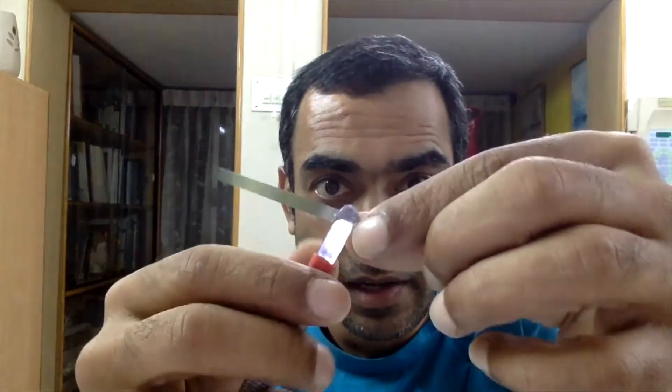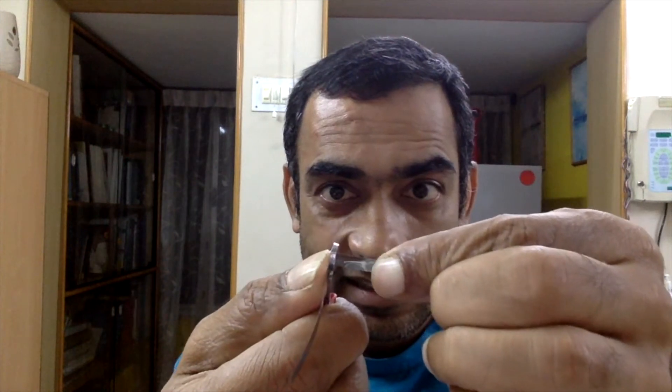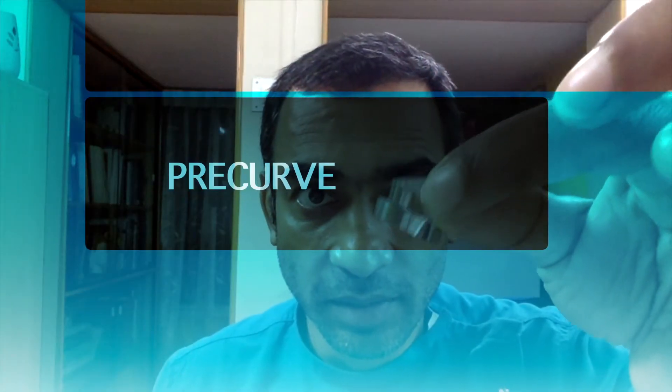Now you have to treat your matrix band. Your matrix band is a flat piece of metal, but your tooth is curved — so you need to pre-curve it. Use the back end of a tweezer to pre-curve the band. You can also take an egg-shaped burnisher and burnish the end to get an additional curvature.